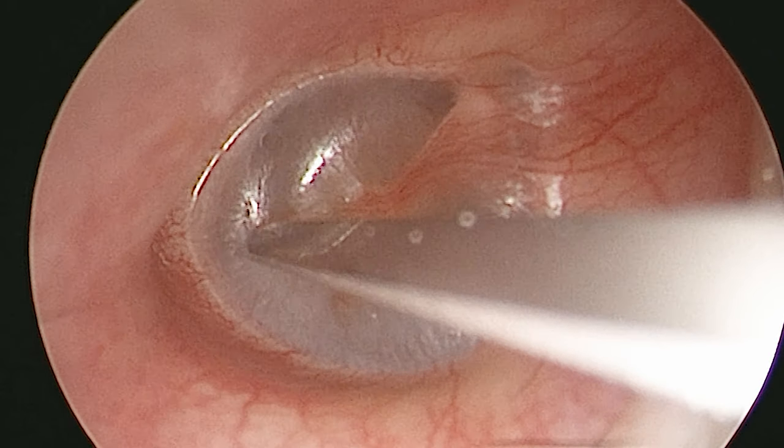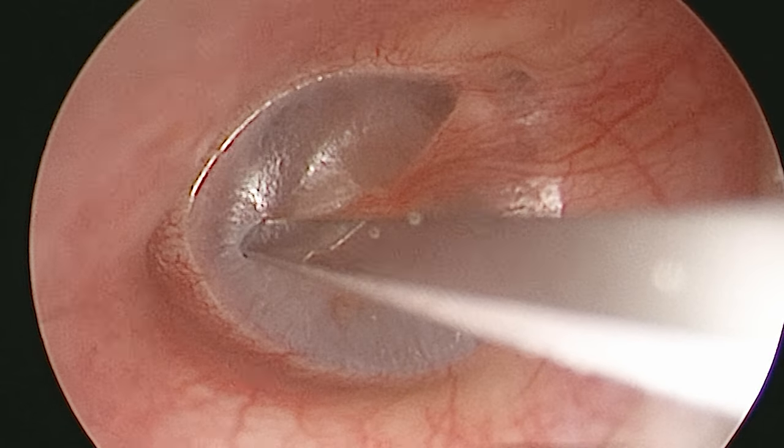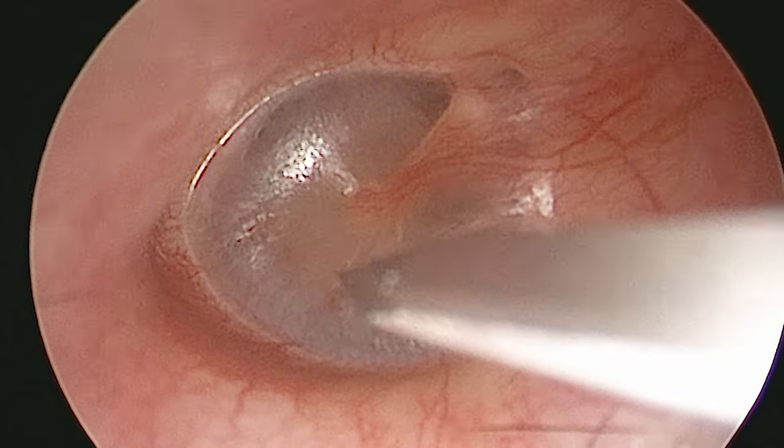As you can see now, I'm making a hole in the eardrum, and we put it in this corner because here we run the lowest risk of causing any damage to the underlying structures.